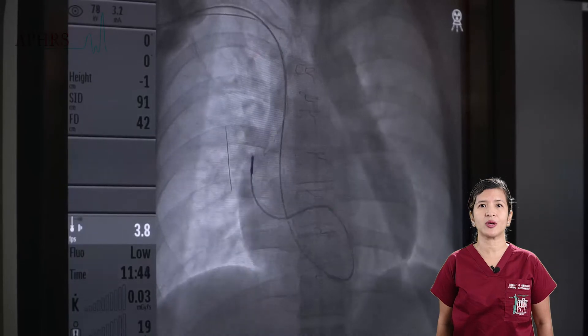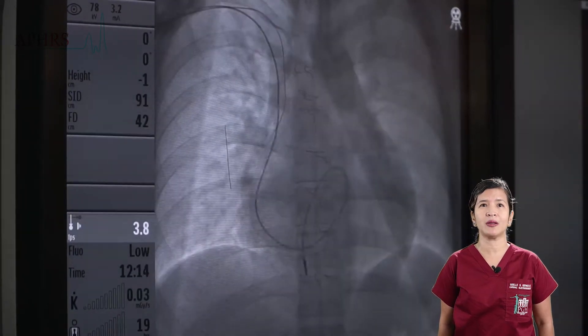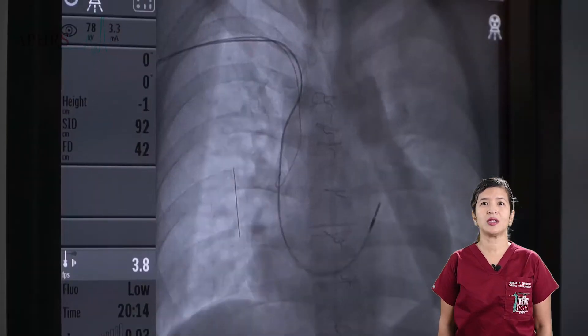Once its shaft is across the valve, the stylet is then pushed in to straighten the lead, with the hope of popping the tip of the lead into the right ventricular outflow tract.